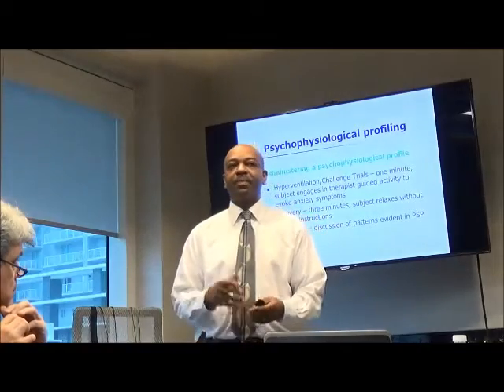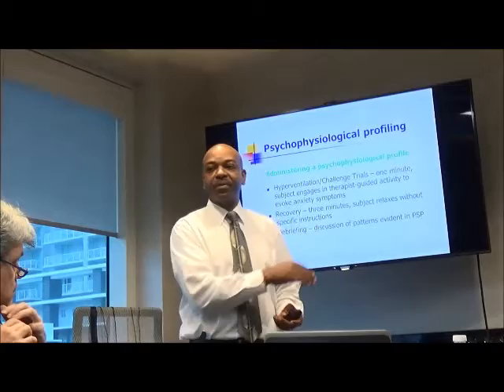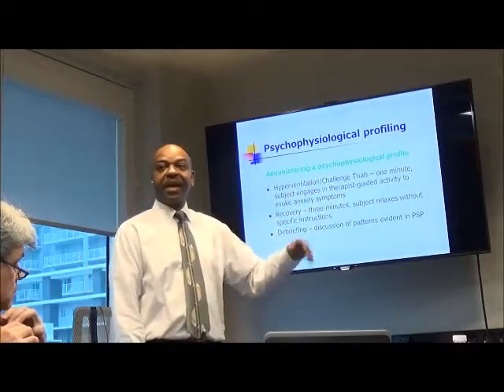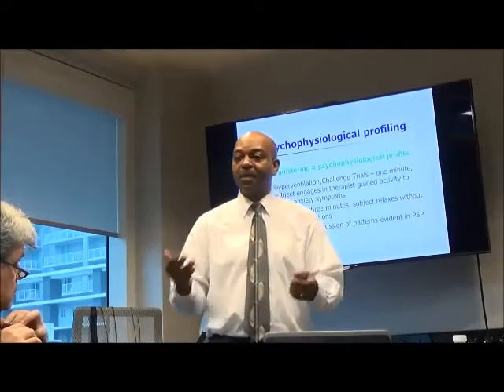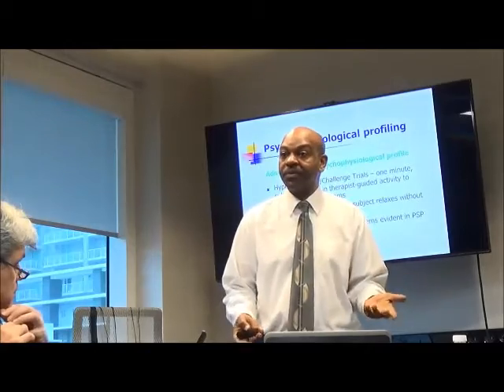Yeah, and I see people actually get excited about the process from going through it, showing the graph and saying, okay, this is when you were relaxing, this is when you did the math, this is when, and they see the reactions and maybe the lack of recovery, and now it makes sense to them why they're coming back and doing this training, so that they can learn to improve those things.